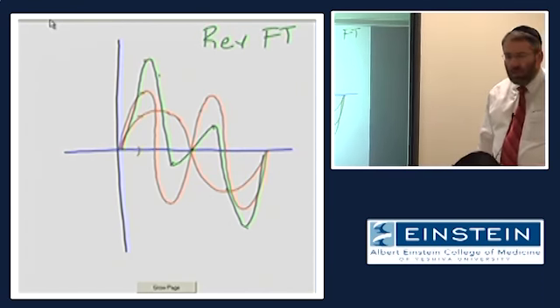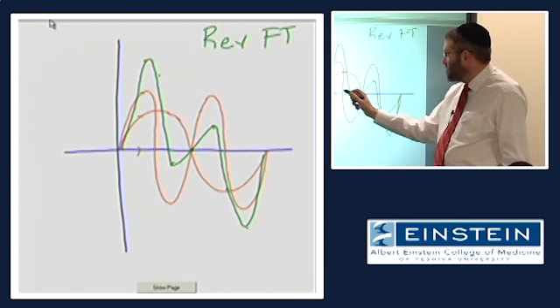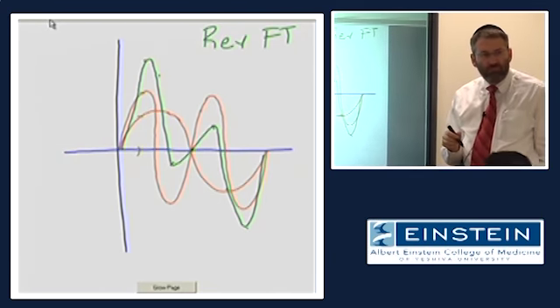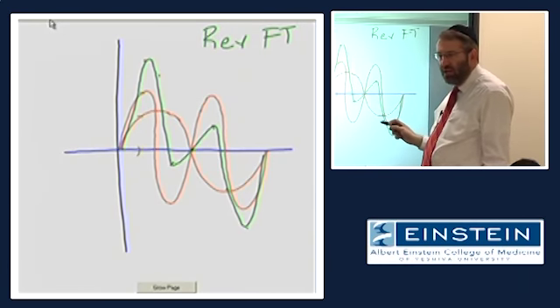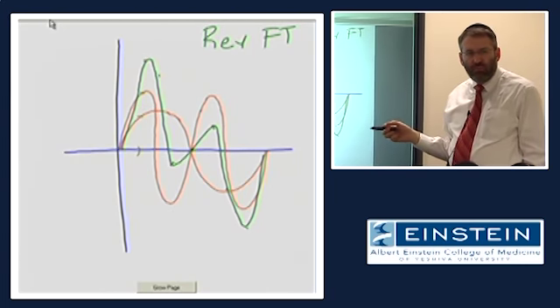The Fourier transform that we're used to, which we're going to deal with, starts with the green and goes in the other direction. So it is essentially able to take this complex function and determine what its components are.